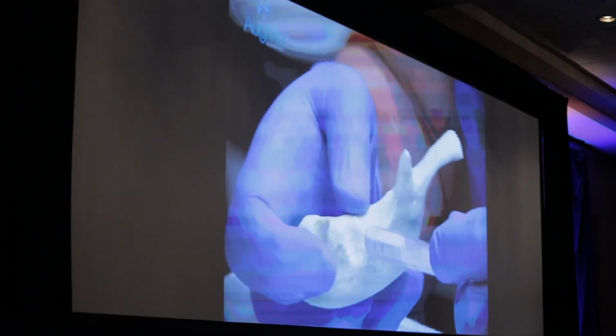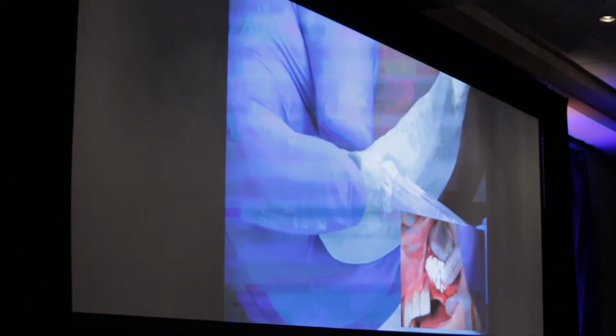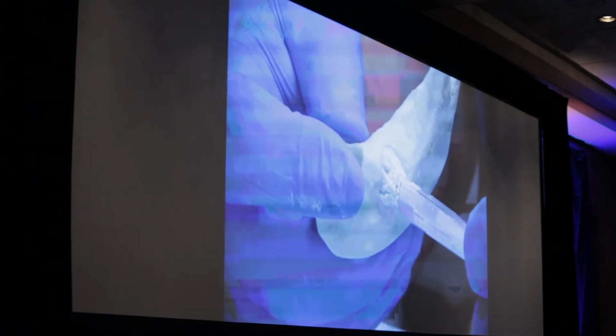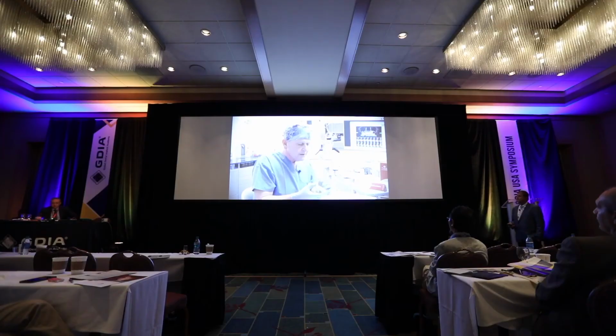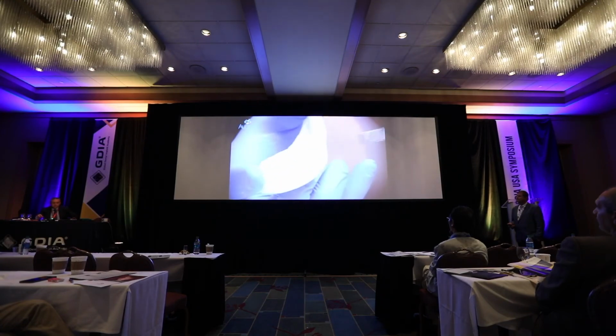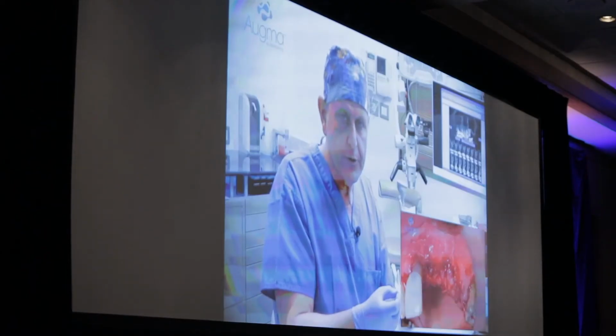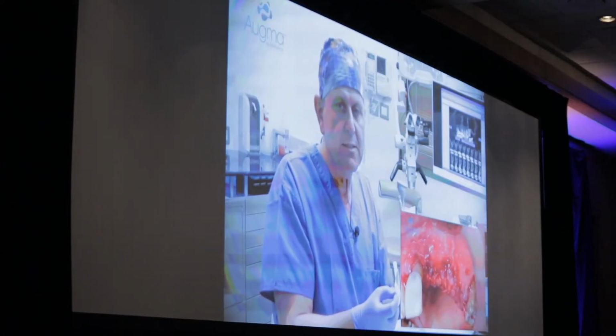Now, let's do it together. Approach the defect site at a 45 degree angle and start ejecting the material into the grafted site at a 45 degree angle. During the ejection, use the syringe head to help you stabilize the material with a small condensing movement. If you need to, you can shake it a little bit and press it again for 3 seconds, and you can close the flap. However, it's very important that your soft tissue is primarily closed and well sutured. That's all. Simple as that.